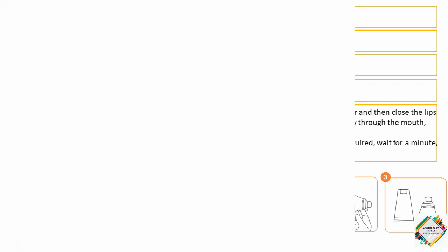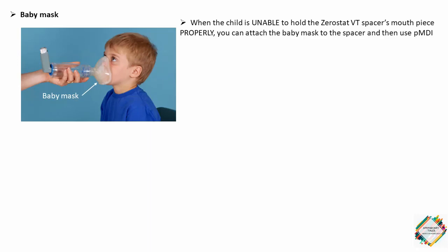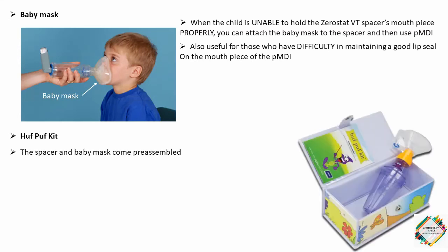The next device is the baby mask. When a child is unable to hold the Zerostat VT spacer's mouthpiece properly, you can attach the baby mask to the spacer and then use the PMDI. It is also useful for those who have difficulty maintaining a good lip seal. The Huff Puff Kit combines the spacer and baby mask in a pre-assembled form, enabling quick delivery of medicine and saving time.